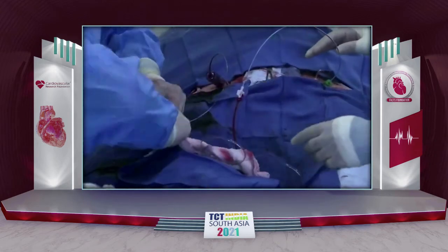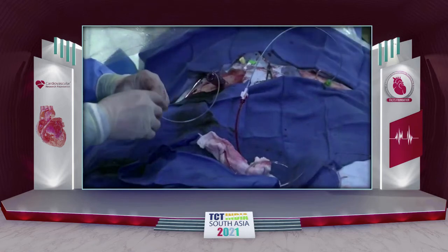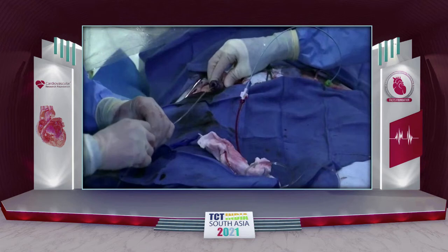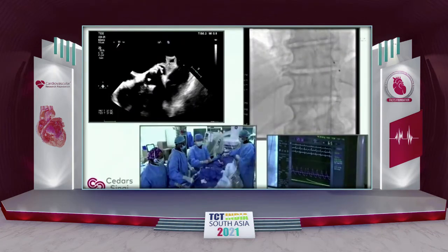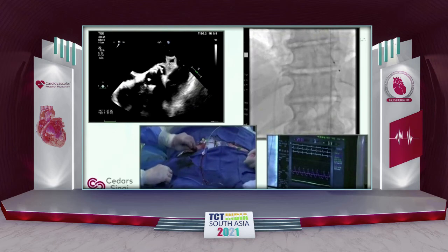I think, Saurabh, what we have seen differently here is two schools of thought. One, they're telling they don't use echo at all. Ganesh said everything is done in the cath lab based on the angio and cine. But here you see the other view where echo pictures are used. It all depends upon how comfortable your echocardiographer is and what your systems are. They showed fantastic pictures where you can confidently tell there is no AR and the valve has expanded quite well. So it's also important to have echo.